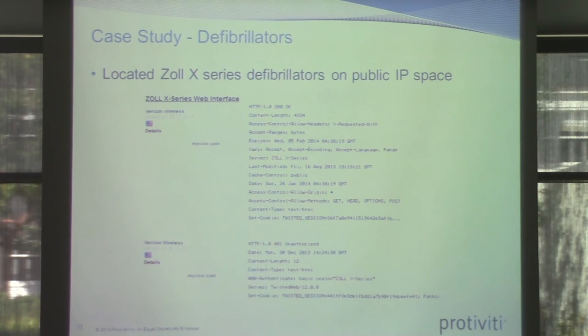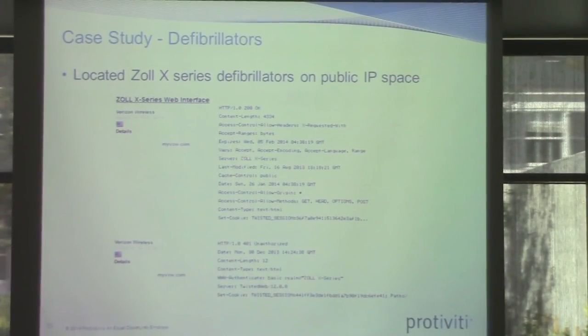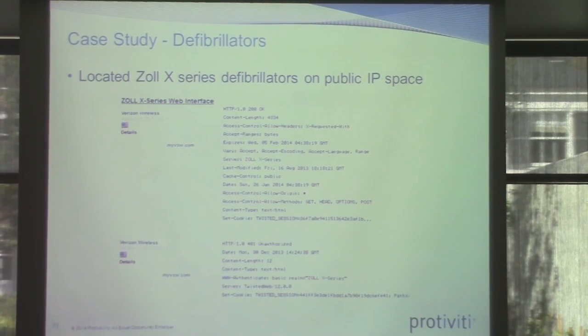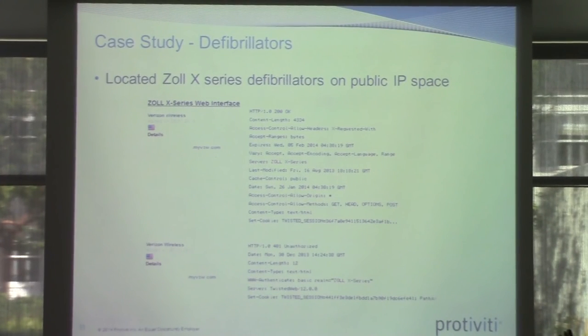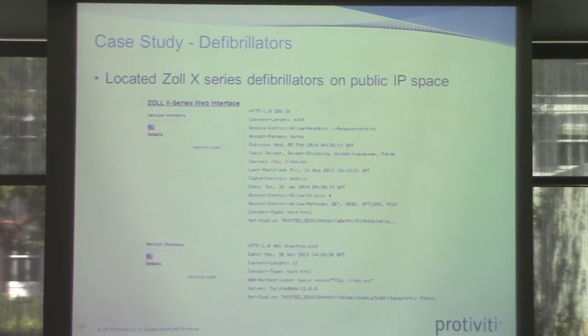We initially will spend a lot of time looking at documentation. So we'll scour the internet, Google, and a couple of other sites to get service technician manuals. Understand the infrastructure, understand how all the components work. Then we'll have a plan: this is the attack surface, this is what we're going to go at. And by the time you're there, if you've done your research ahead of time and looked at these devices, probably 80% of the time, if you think you've got an attack path that's valid based on this, you're going to get it.